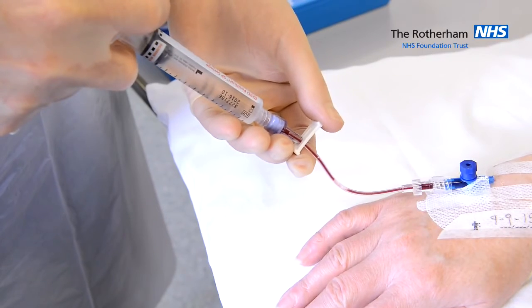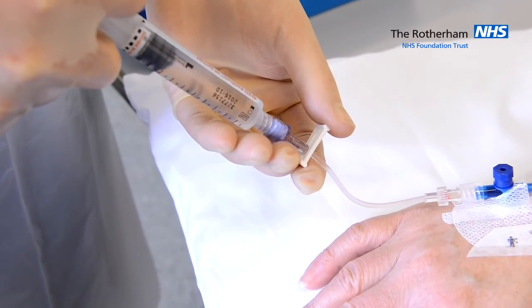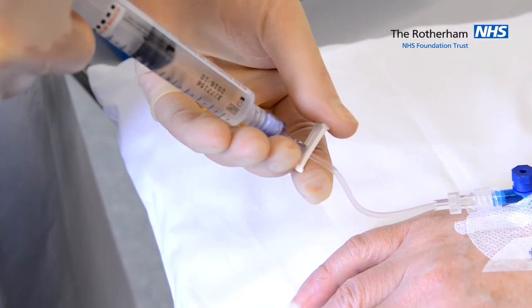Once you have obtained your blood culture, flush with normal saline and clamp under positive pressure.